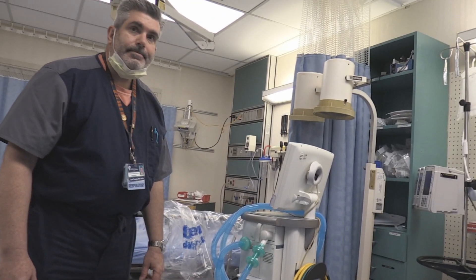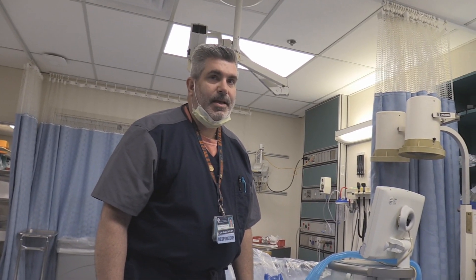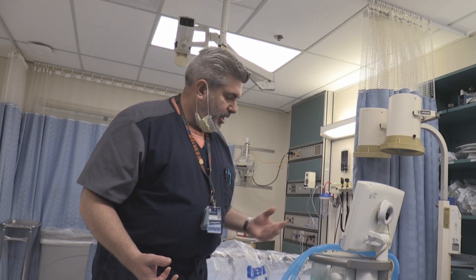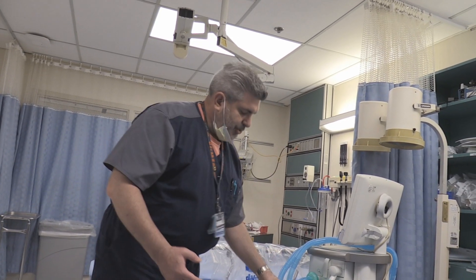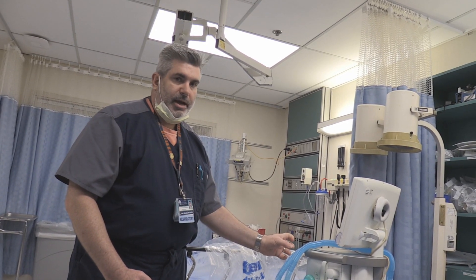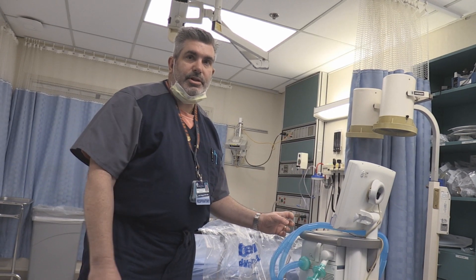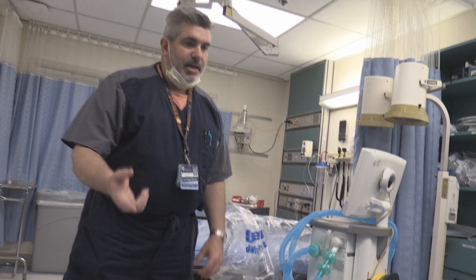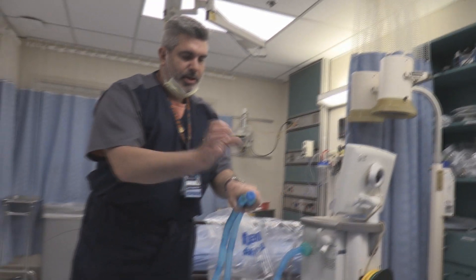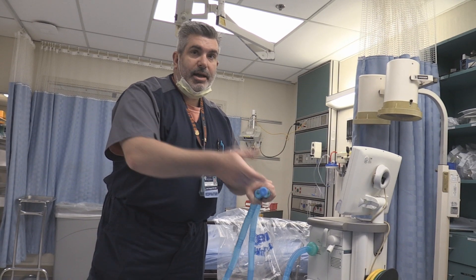If you want to do nebulization with albuterol: normally at our facility we use the Aerogen neb with our ventilator patients, placed on the inspiratory side just past the humidifier, so the aerosolized particles go directly into the patient. In the case of using MDIs, we would have a ventilator spacer placed here between the ventilator Y and the ET tube, and you would actuate your MDI to deliver it to the patient.